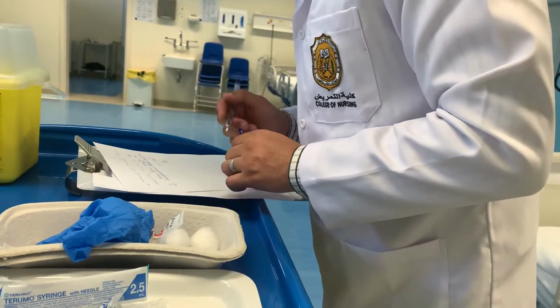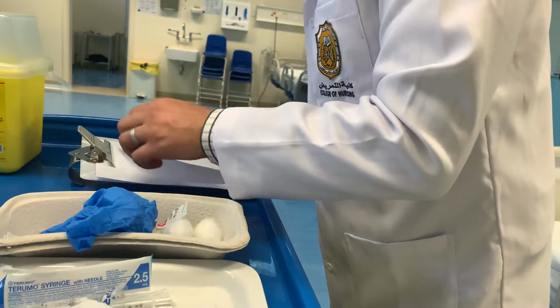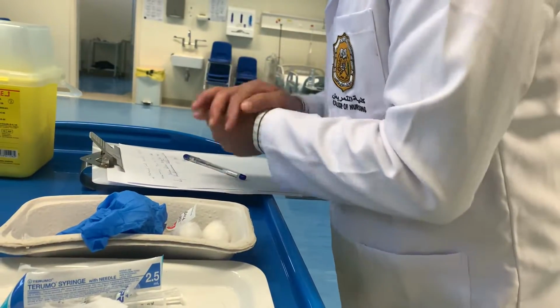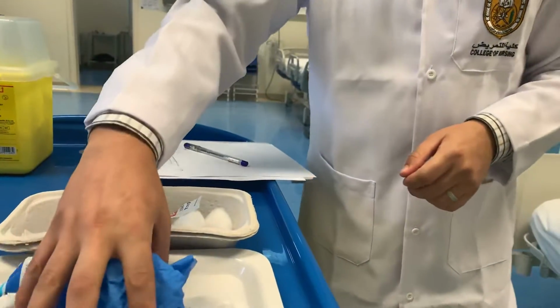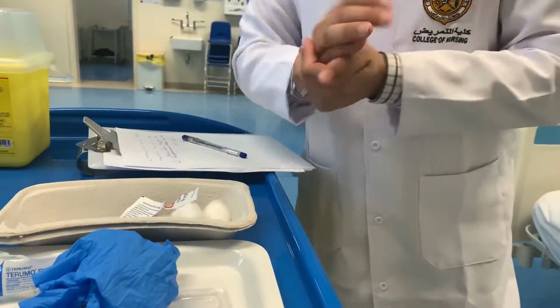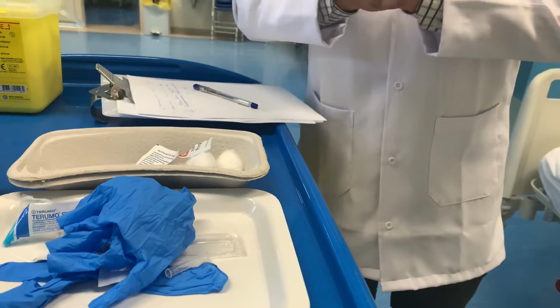Then I need to sign my name on the system in order to verify the medication has been given. Finally, I will clean everything according to the hospital policy, and that will be all.